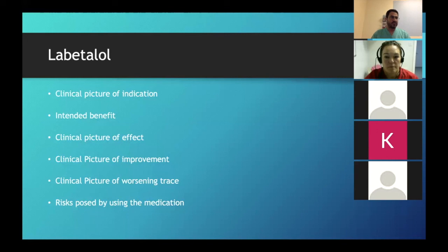Because you said it can still accelerate as well. It can still accelerate. Can I use that to my advantage? Yeah. So if I stimulate the baby, the well baby is going to accelerate. If I stimulate the baby and it doesn't accelerate, then this baby can be unwell and is decompensating. Does that make sense? Yeah. Okay.